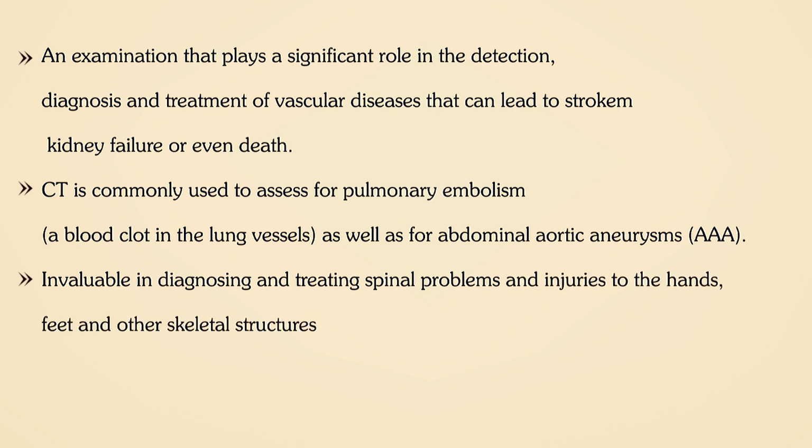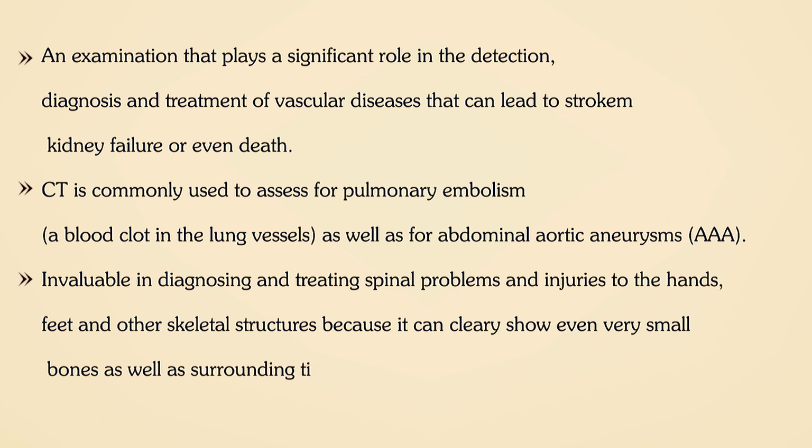It is invaluable in diagnosing and treating spinal problems and injuries to the hands, feet and other skeletal structures, because it can clearly show even very small bones as well as surrounding tissues such as muscle and blood vessels.